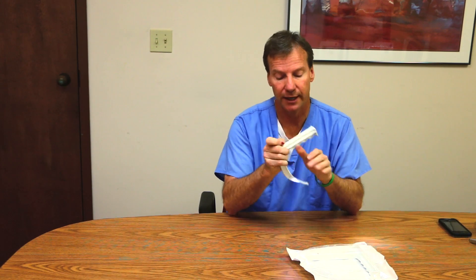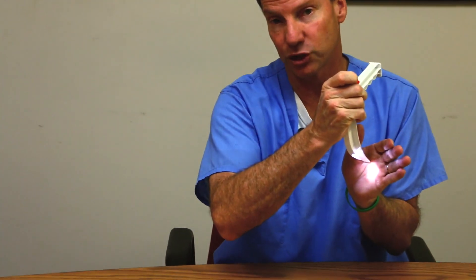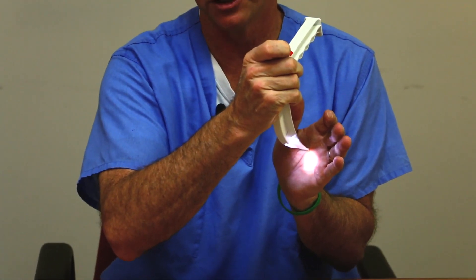It is very sturdy, but the impressive part of it is the light source. When I pull out this red tab, you get a very bright LED light source that is great for intubations.